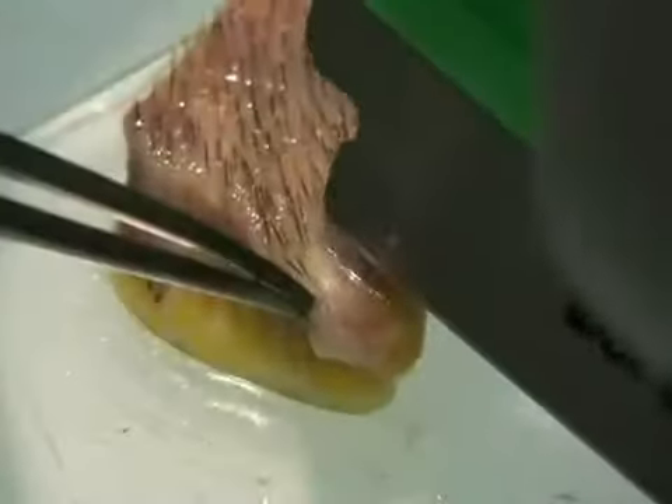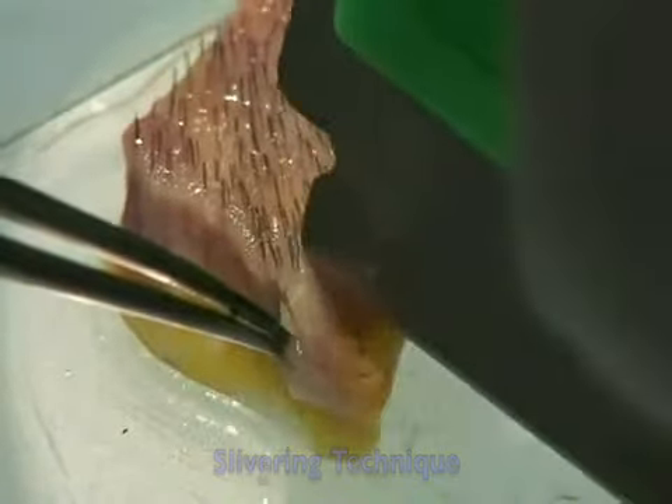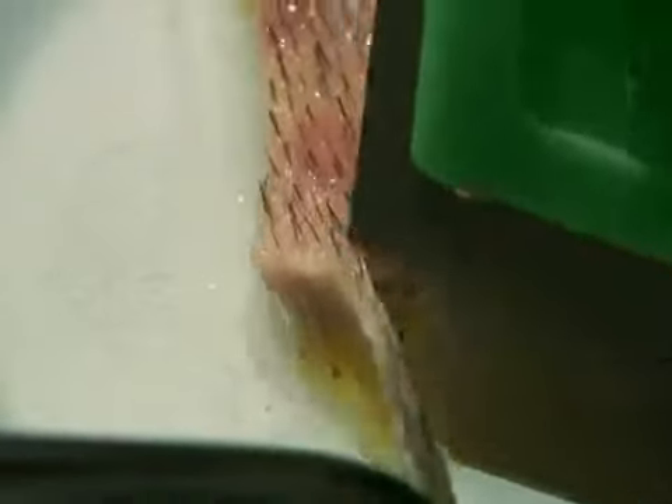The slivering technique is one of the most important parts of preparing grafts. To have great grafts, we need to have great slivering. And to do that, we have to keep the follicular units intact.